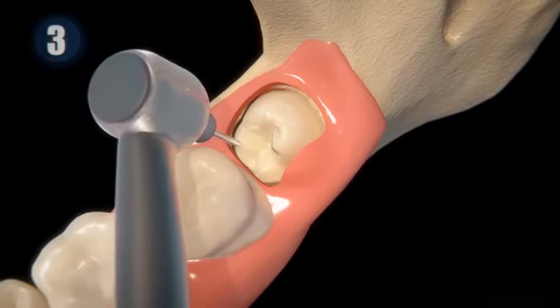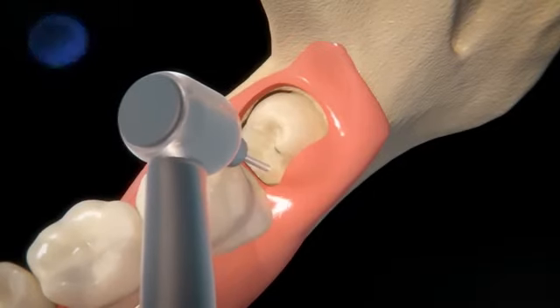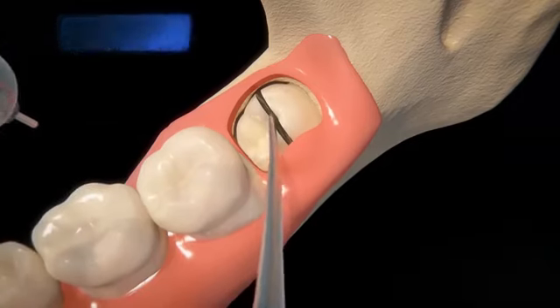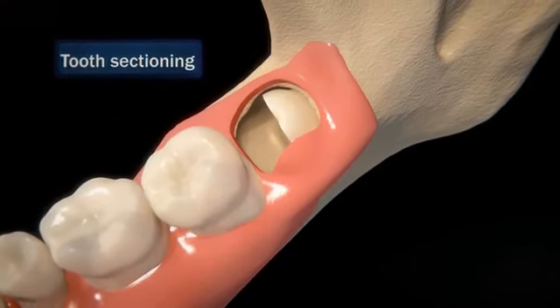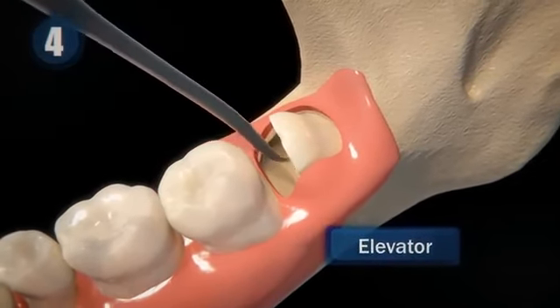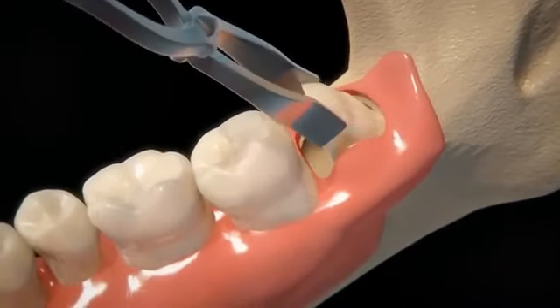Later, contouring will be carried out at the level of the tooth, bone, and then a cut in the wisdom tooth with devices called piezoelectrics, which are used to divide the tooth into parts so that extraction is easier, a process called tooth sectioning. Once the tooth is divided, the dentist will use an instrument called an elevator to push the tooth out. And then with the help of metal tweezers, the expert will proceed to pull it until it is completely out.